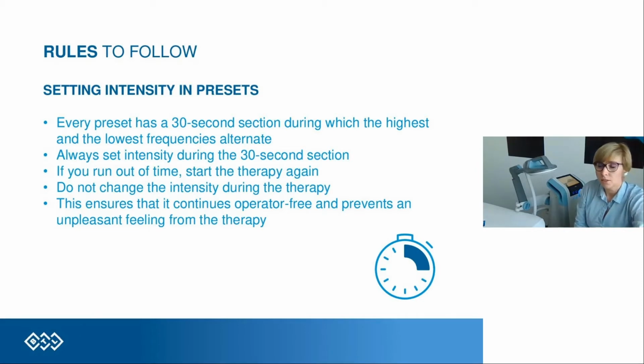And this is the time where we have to find the motor point we want to treat and to apply the exact intensity level.